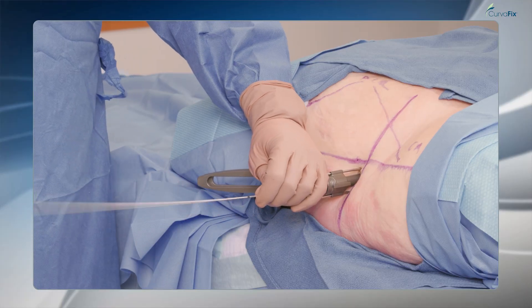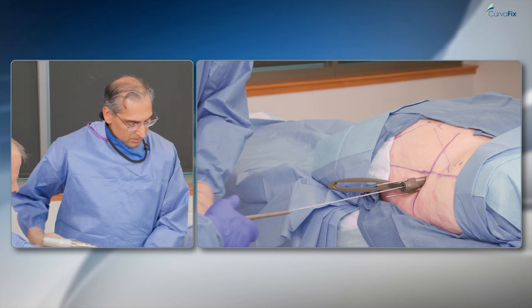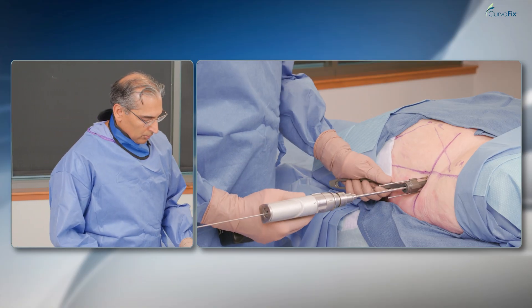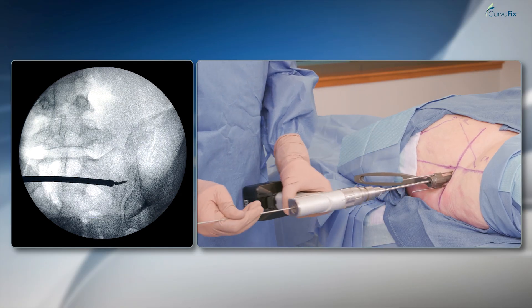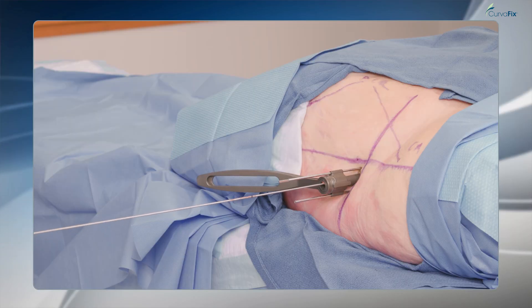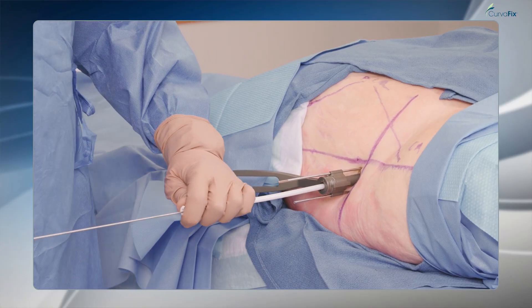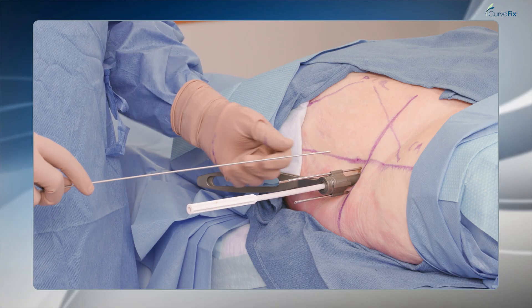This is going to take a few more steps. I'm going to put this in and ream up to my ball tip, take it out, then insert the drill component. I'll ream around the S1 tunnel, up to that ball tip. Then I'll remove my drill, put my exchange tube in. The exchange tube — the white exchange tube — goes through the middle cannula and allows for the drill tip wire. I've seeded my exchange tube, now I'll remove my ball tip guide wire and insert the drill tip wire. The drill tip wire will allow me to get through that cortical bone, and then I can reapply my ball tip guide wire.